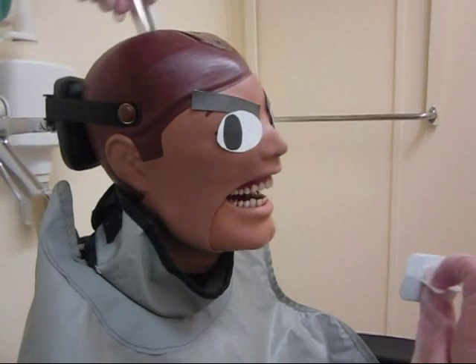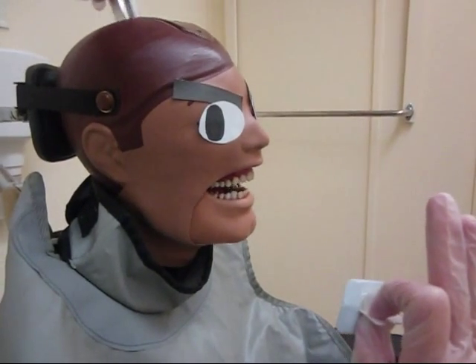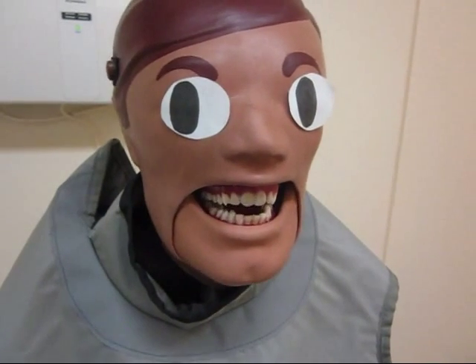Oh! Oh, what happened? That really hurt. I really do not like the corners of the x-ray. Is there any way you can make it more comfortable for me?